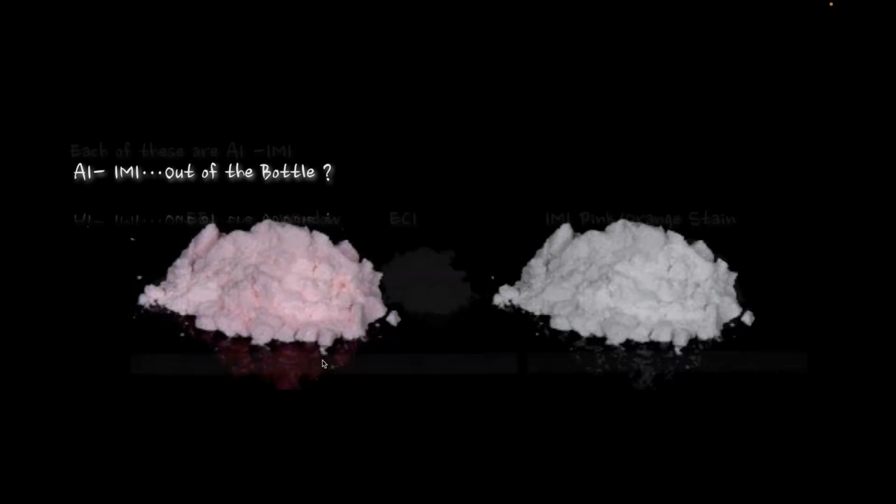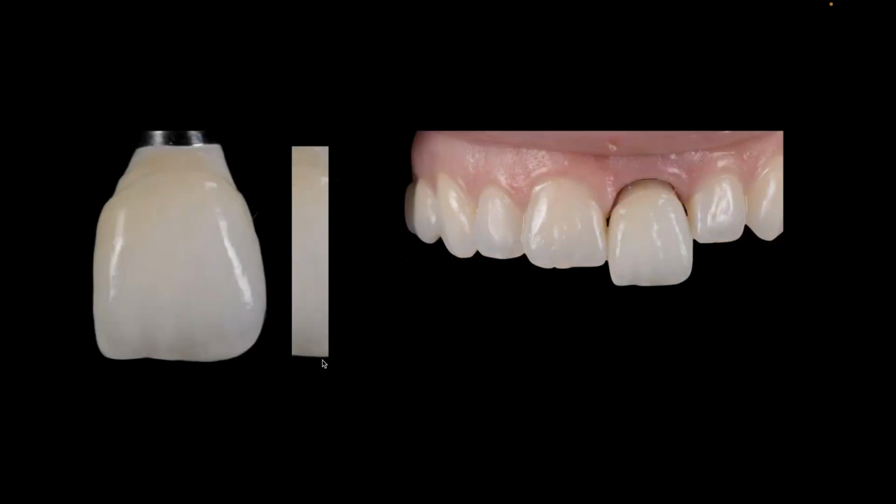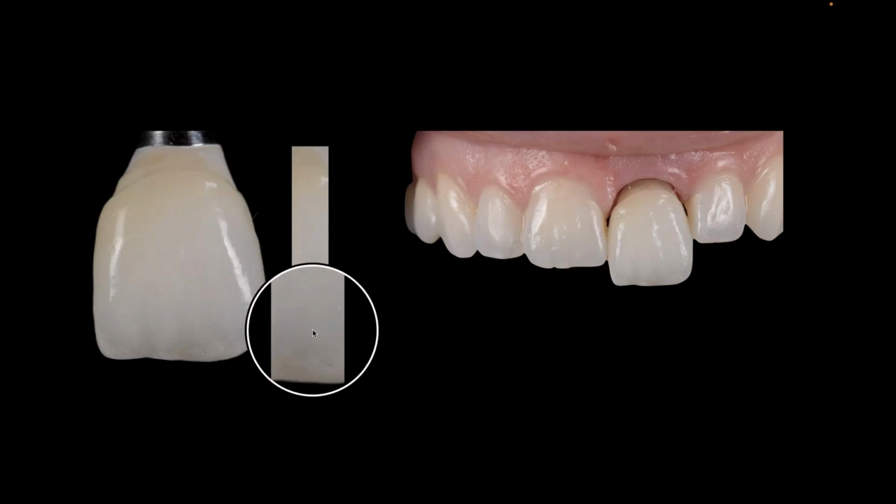But when I'm really looking to enhance all the colors that I'm seeing in natural tooth, especially on a single central or on a veneer case, a lot of times I'm doing a lot more additive and mixing as I've gone through, again, before in some of the layering courses. So for a case like this, I wasn't able to take one color out of a bottle. I have to really look through all the processes and try to match what I see in this tooth. And you can see all the colorations that come through here.